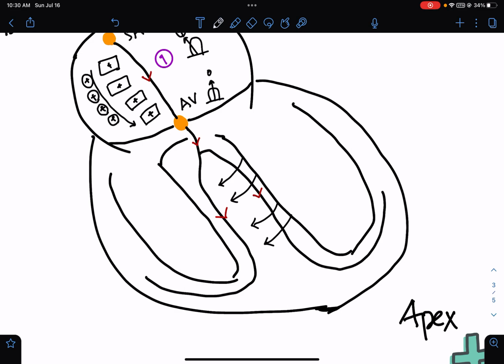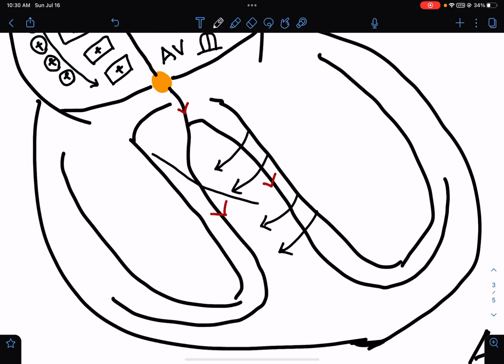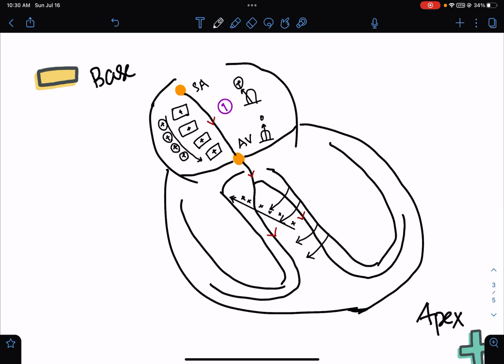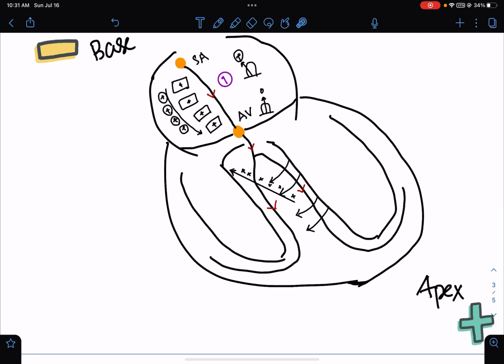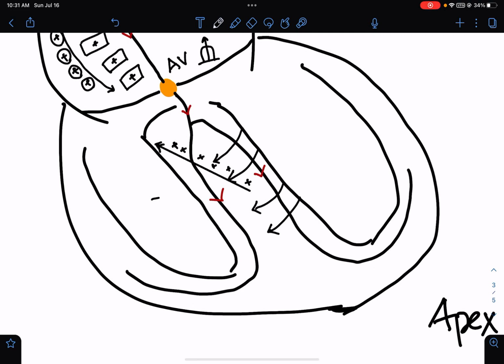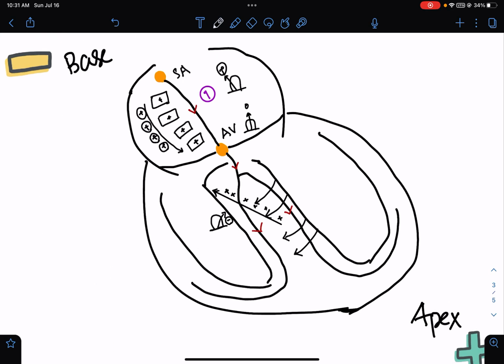In the case of septal depolarization, let's see with our vector. Okay, here this is our vector arrow. Because of depolarization, there will be a lot of positive charges, and the vector is a positive vector, right? So the arrowhead is directed towards where? Negative. This is a positive vector. If a positive vector is moving away from the positive pole, the galvanometer will show negative, right? Okay, so here is our galvanometer. Let's imagine that and move to negative. And we'll draw that electrical activity in the waveform later, right?